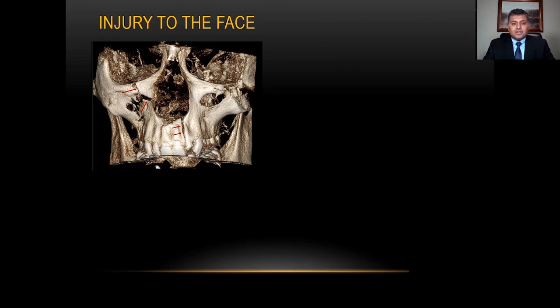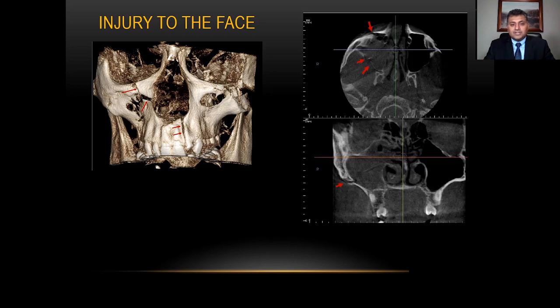Let's take a look at this case. The patient received trauma to the face. On this 3D surface rendering, you can see a break in the continuity of bone and fracture lines. The right orbit shows an infraorbital fracture. There is also an alveolar fracture in the area of teeth number 8 and 9 — between teeth 9 and 10, you can see an alveolar fracture.